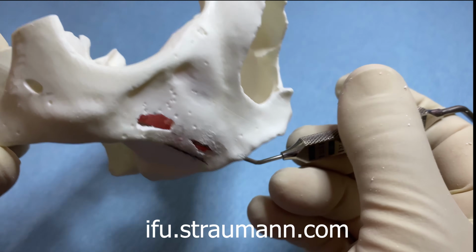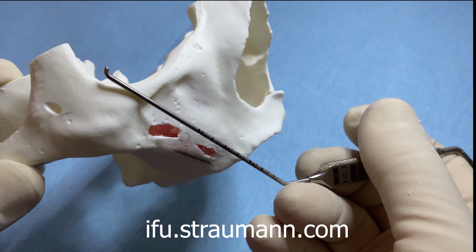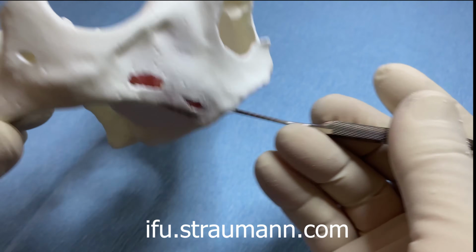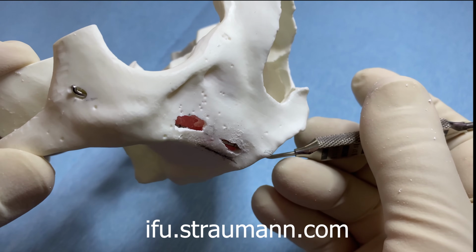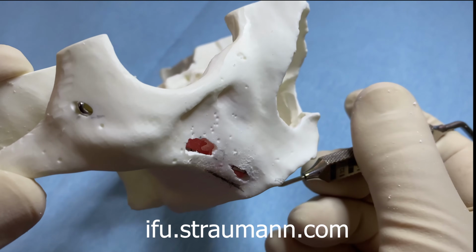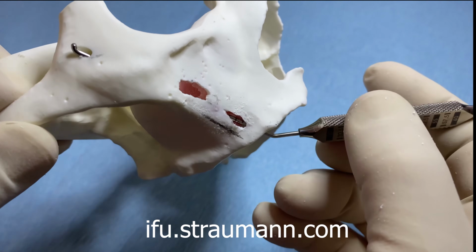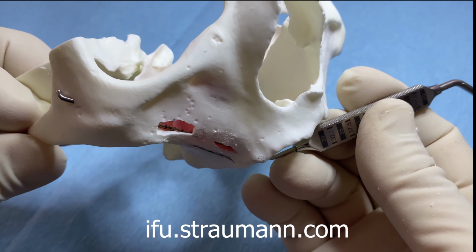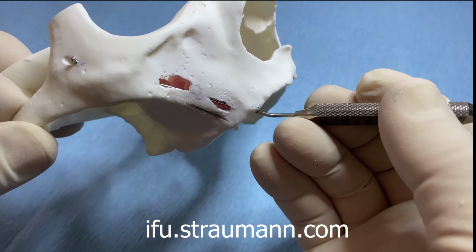So this idea of placing a zygoma implant in the orbit is incomprehensible to me, because if you have to see the tip of the drill, and then you have to see the tip of the depth gauge, it is impossible to place the implant into the eye. So that's a very dogmatic thing that we have to follow. We have to know where the implant starts, we have to know where the implant ends, and be aware of the whole trajectory. And as you can see here, the depth gauge is butt up against our lateral sinus window wall, and we are in the right position.